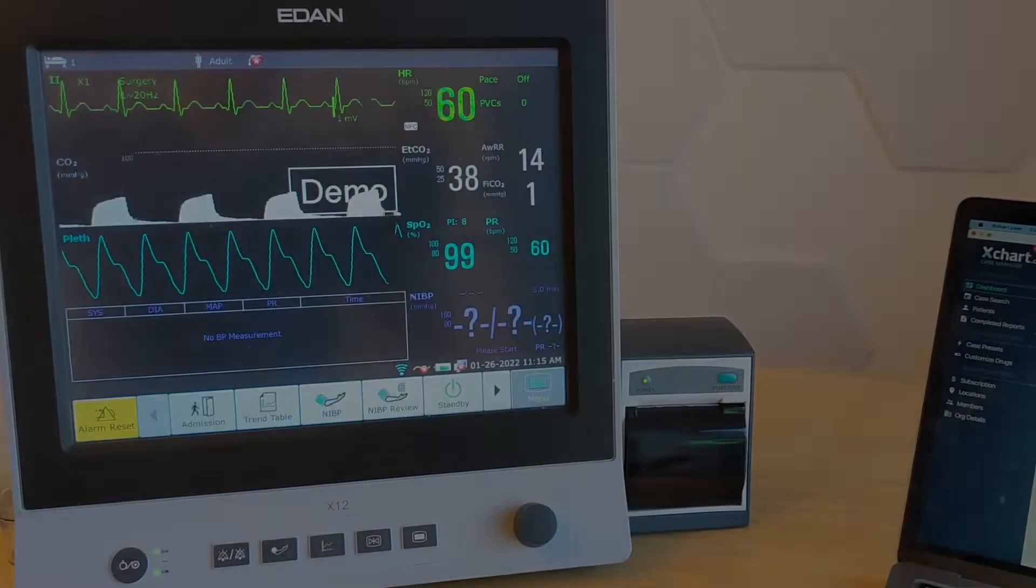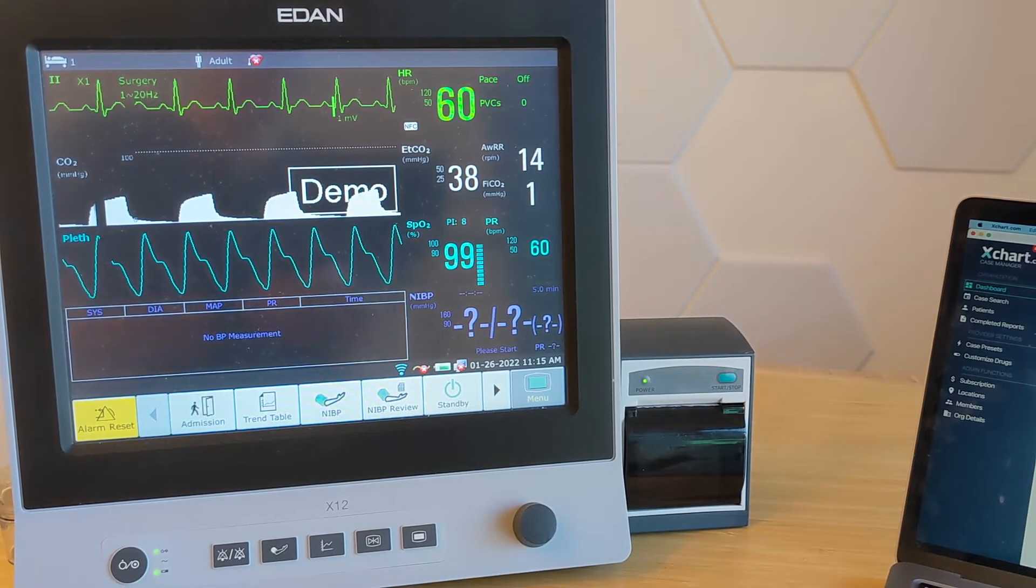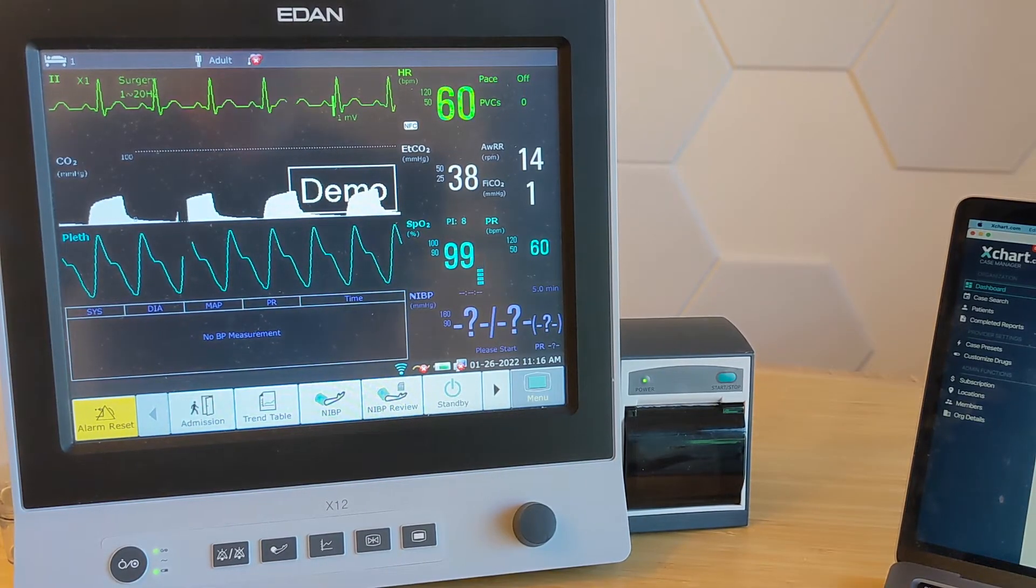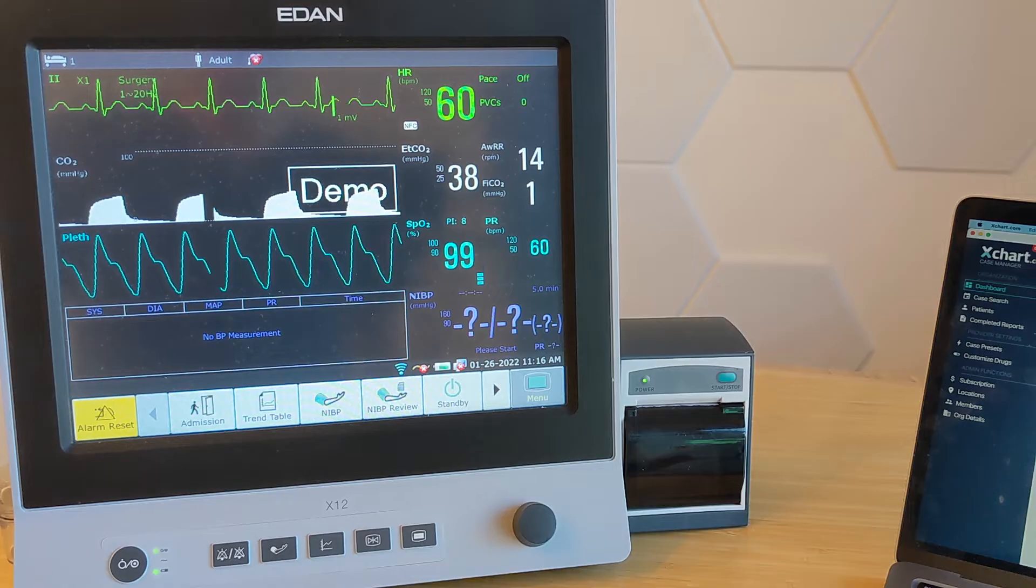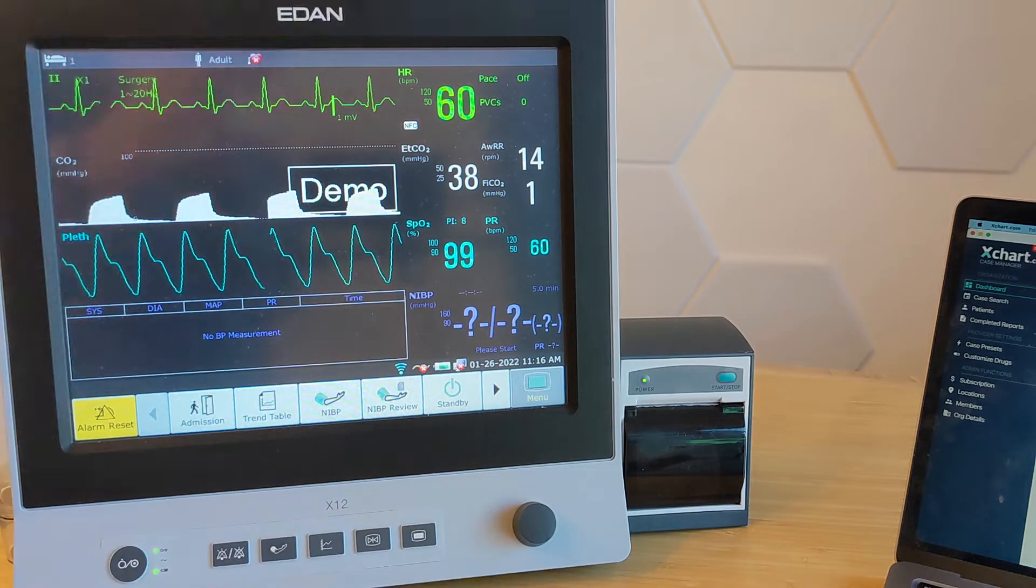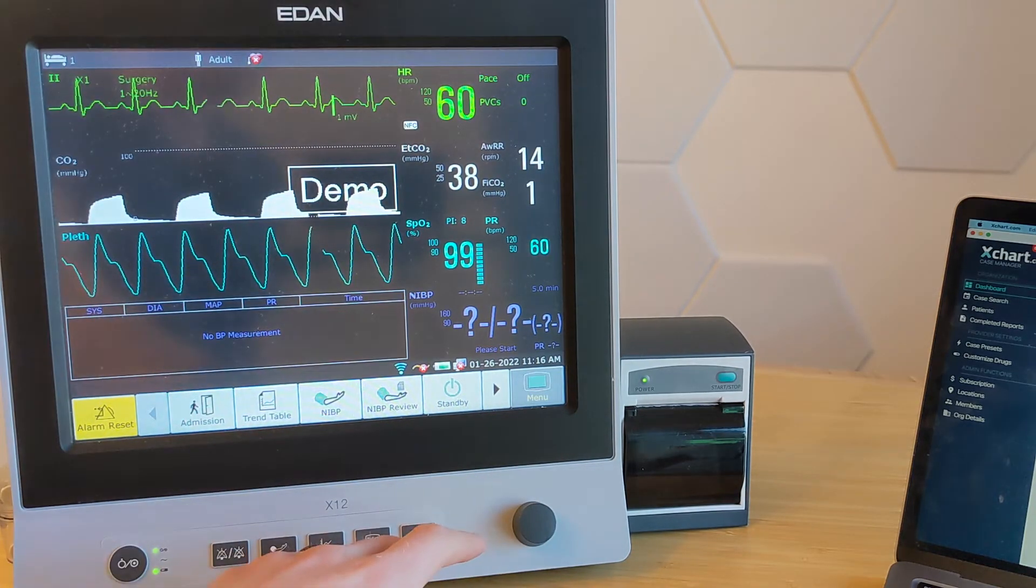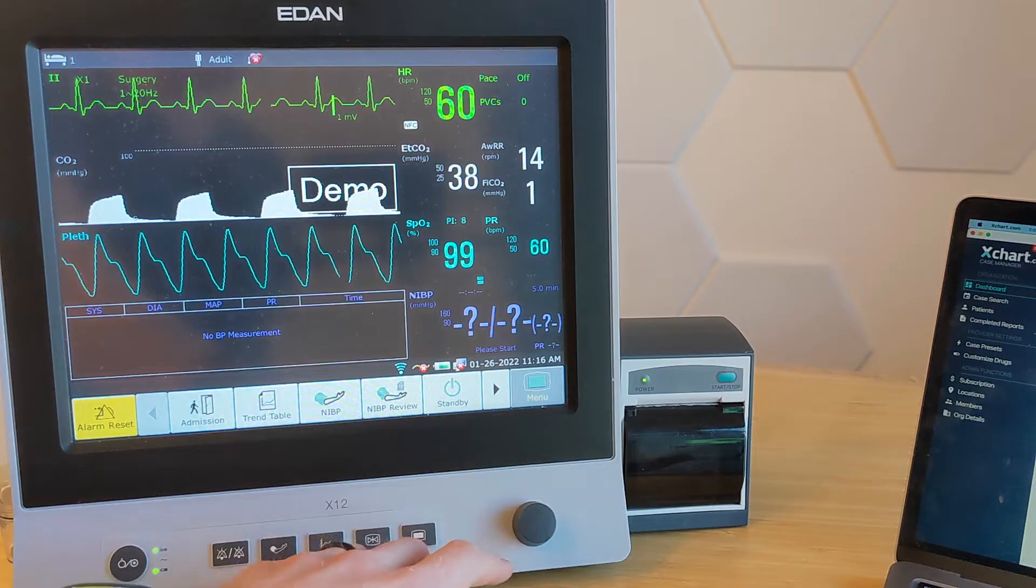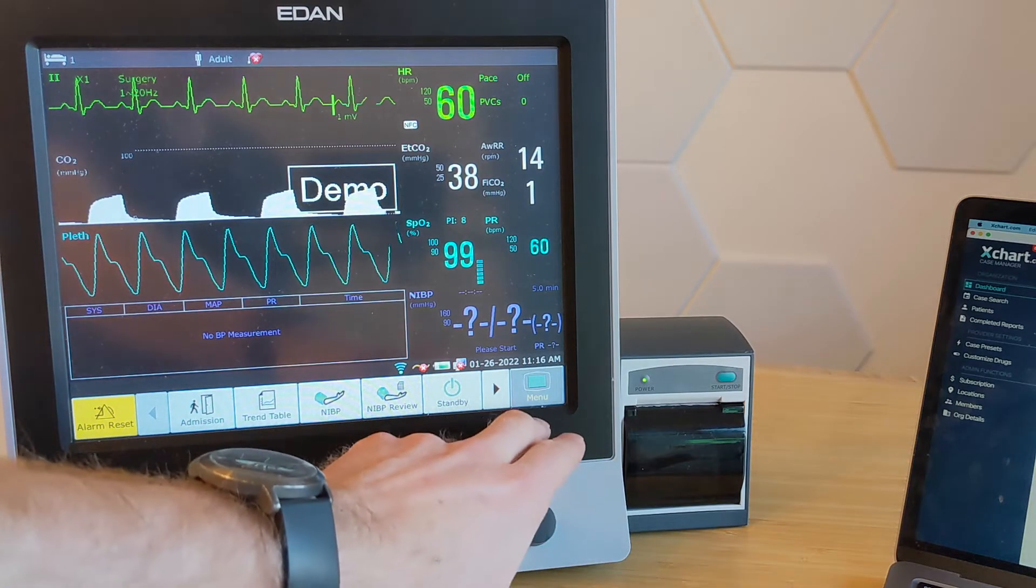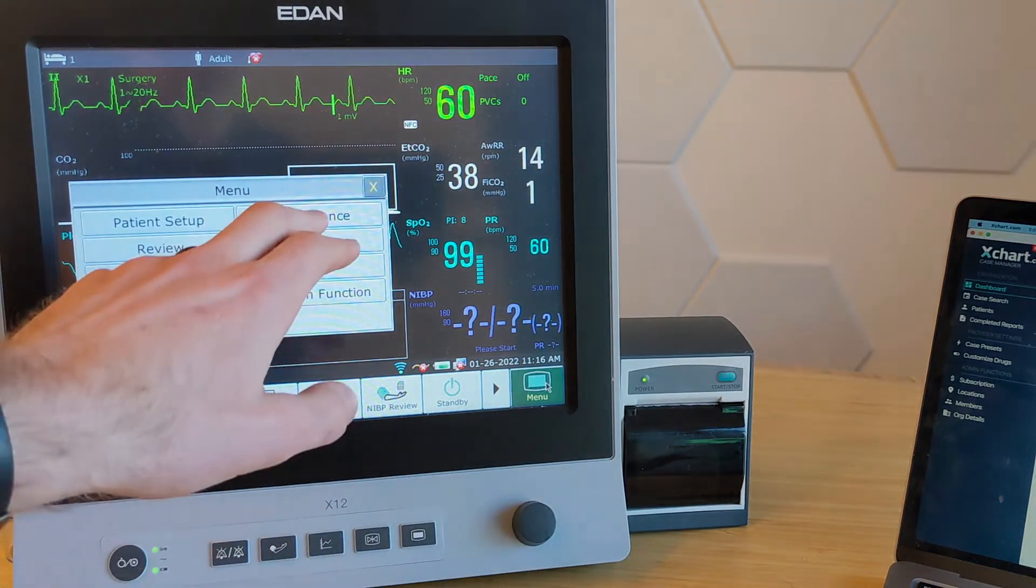There's a few key things that you have to do on the Eden to turn on the ability for us to talk to it at all. First thing you're going to do is, there's two ways of doing it, you can do it with the Wi-Fi or you can do it with a wired connection. I'm going to show you both. We're going to go to the menu and we're going to hit maintenance.